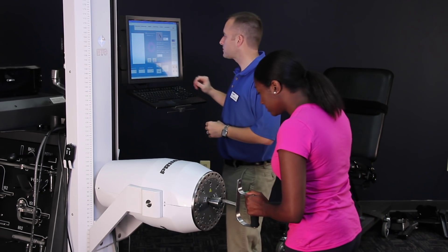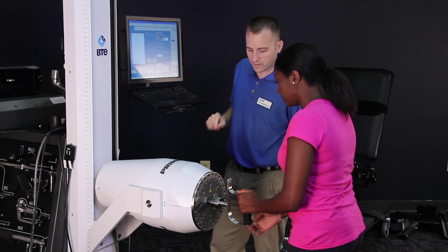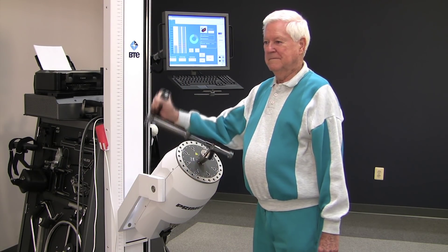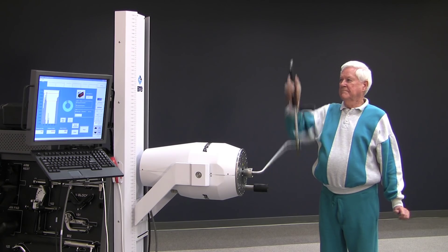All the attachments are easy to insert. Many clinicians like to have their patients attach the tools themselves — this gets them doing a little bit of problem solving using both hands. Tools are easy to connect, and a little turn on the collar locks them into place. Normally in a treatment program, patients use five to ten different attachments to perform different activities, and it's easy to go from one setup to the next.